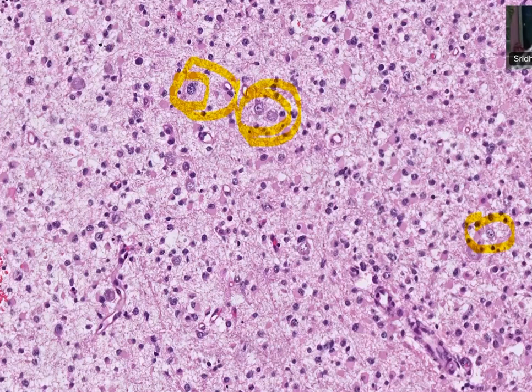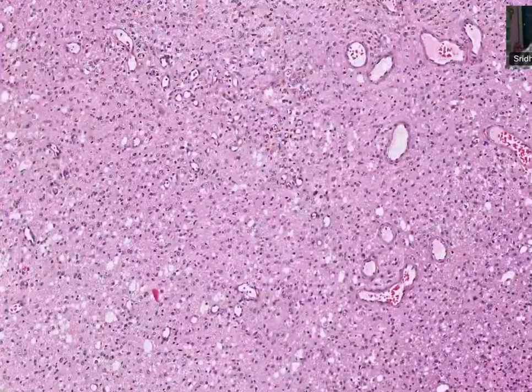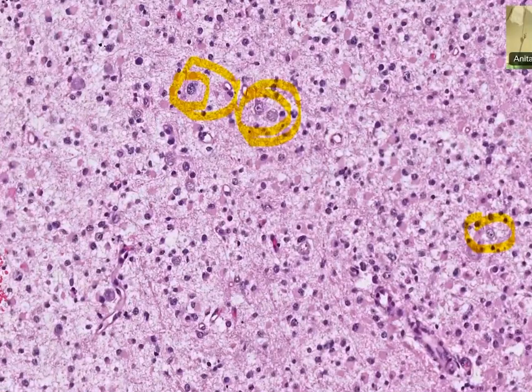You must have seen the slides earlier also, right? Did you look for it? It's not that evident, so you can't see a mitosis here. Is it important for a mitosis to be seen? Why is the mitosis important? For the grading. What is the grade difference? If you find mitosis, where do you go? If you don't find mitosis, where do you go?